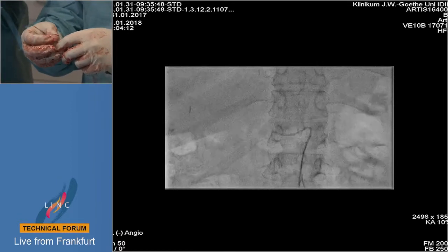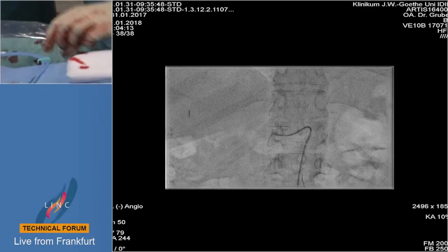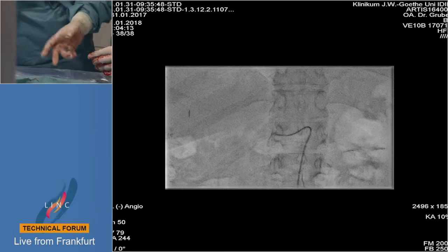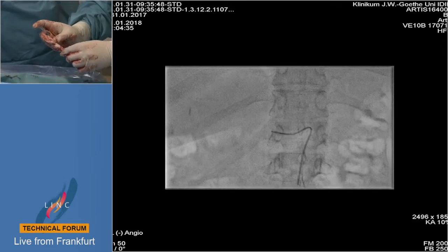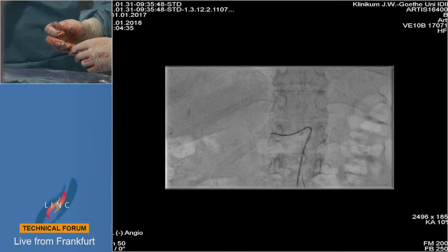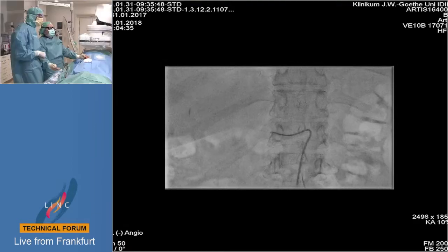I think everyone who has used transradial access has a happy patient later on with a system occluding the puncture. But the big problem is that this is for ambulant therapy, and we don't have that for chemoembolization and stenting. So we can do that, and we have done that. I think most of our guys have done that, but it was introduced and developed for something else. So, cost.